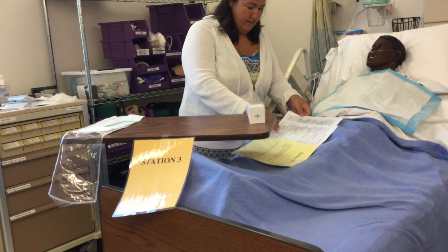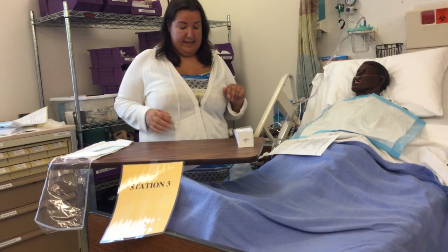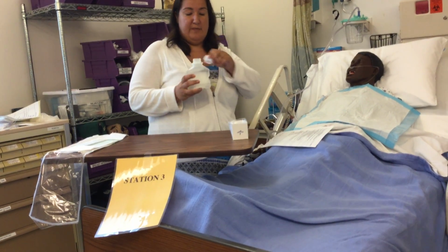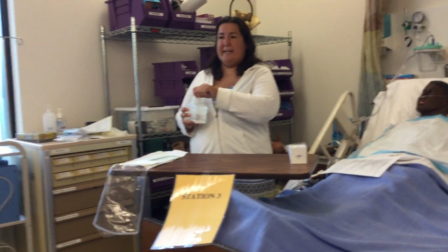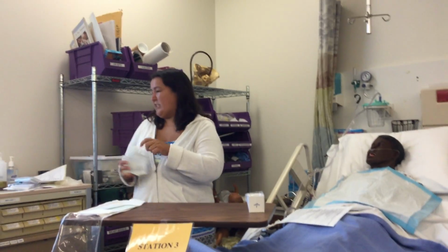And let me make sure I don't forget to say anything. So now I've got that. You're going to take your saline. If it's been pre-used, you want to lip it and then pour some in here for yourself. And then you get this out of your way. Lipping it means you just pour a little bit out so it's as clean as it can be. If it's new, you don't, you just pour. If it's been pre-used, you pour a little bit out into the garbage, and then you pour it in, just making sure it's cleaner.